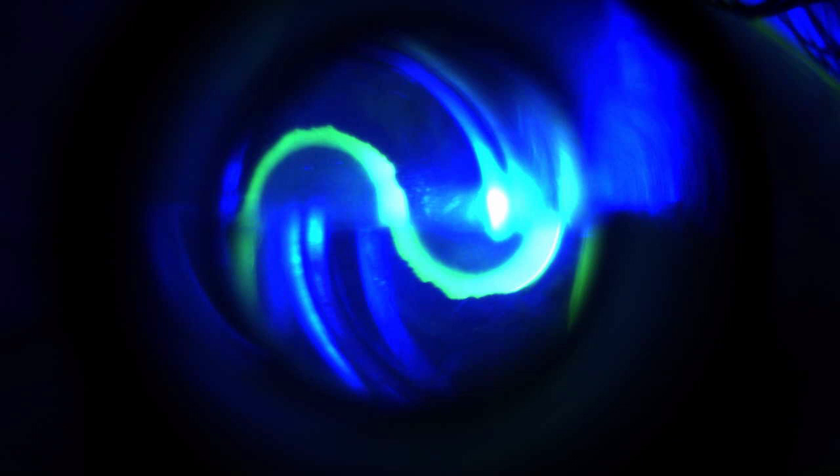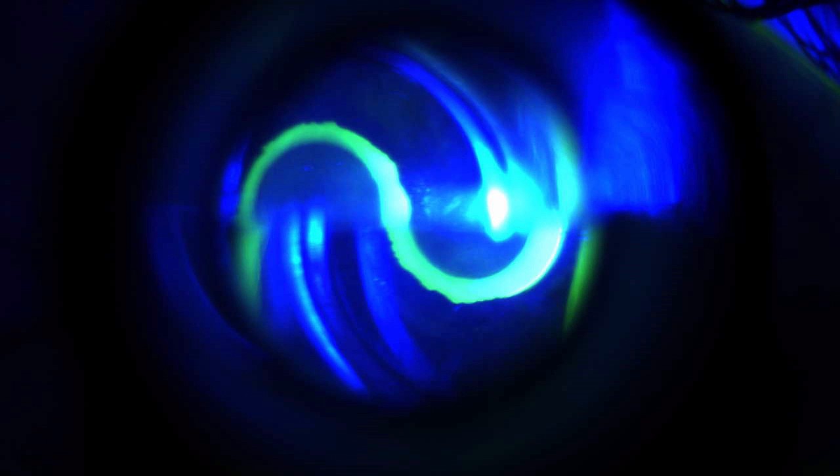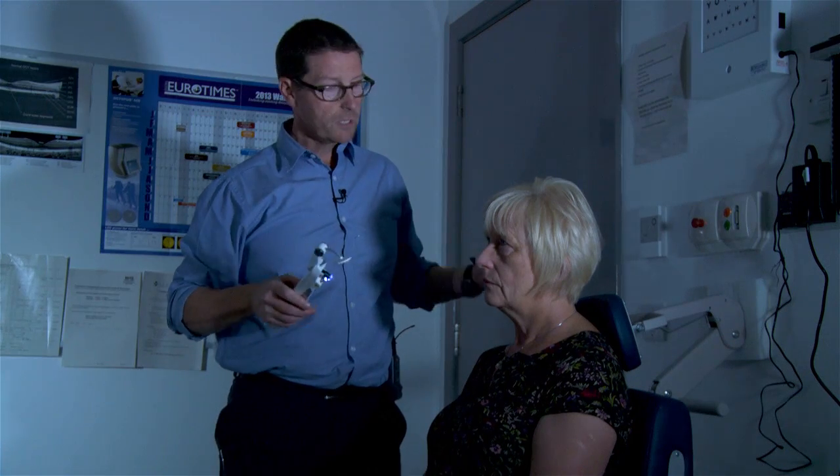Check the mires and that's almost exactly correct — so pressures are about 17 in that case. Nice and straightforward, nice normal pressures.